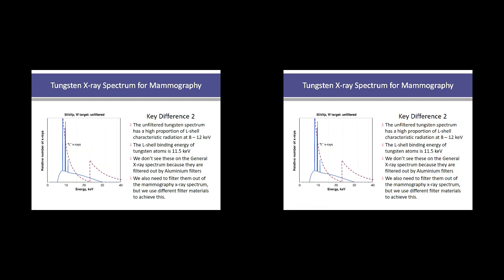And what we also need to do in mammography is filter them out. But we don't generally use aluminium as our filter material in mammography. We use different materials to achieve that.